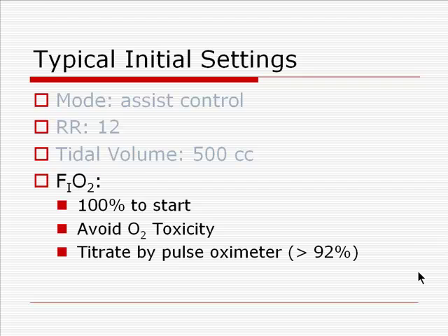Regarding the FiO2, most physicians would recommend starting with 100% FiO2 and rapidly reducing the level of FiO2 to a non-toxic level to avoid oxygen toxicity. Oxygen toxicity can develop quickly, or it could take several days. But rather than risking that possibility, one would reduce the FiO2 to the least amount necessary to maintain an adequate saturation as quickly as possible.